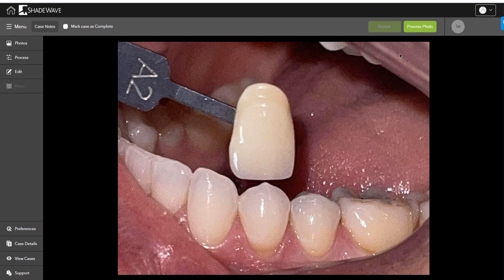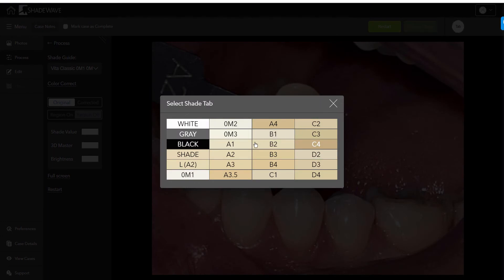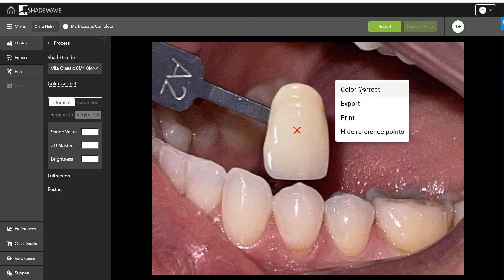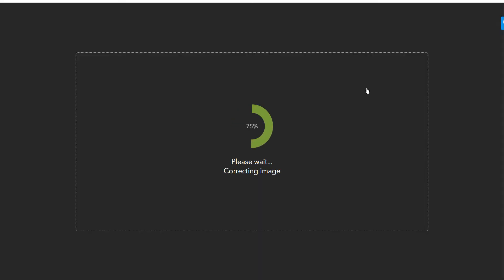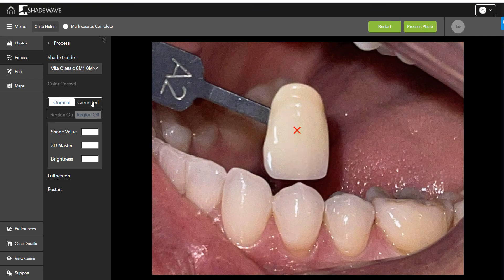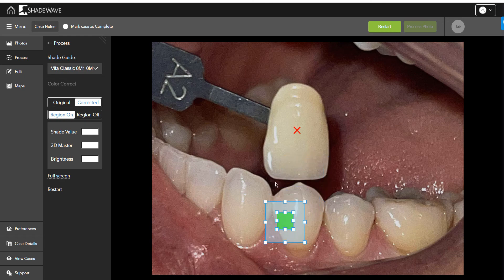Click on 'Process Photo,' then click right in the middle of the shade tab and tell the program it's an A2. When you right-click and color correct, you're turning the A2 into a mathematically correct, standard A2. Here's the original and here's the corrected one. Now let's put the region back on.